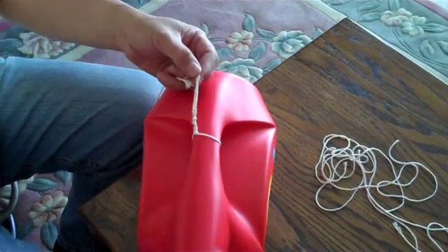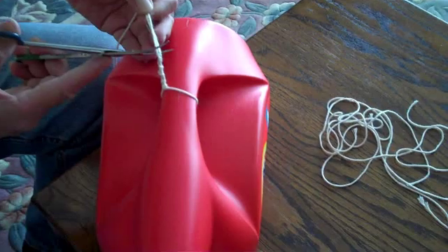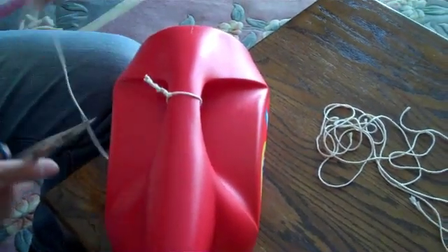If you want to be ready to cut, you take your scissors and you slide them down to the knot. Turn a little bit. Cut. You won't cut the knot.